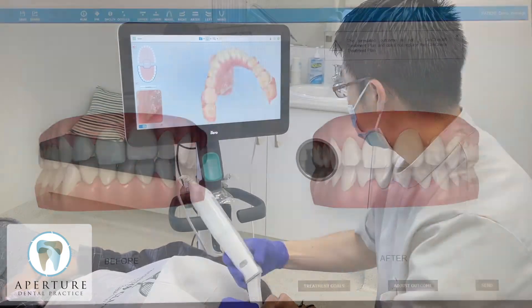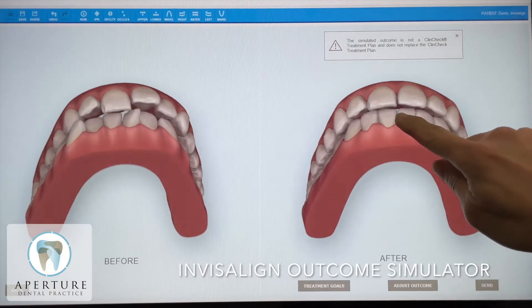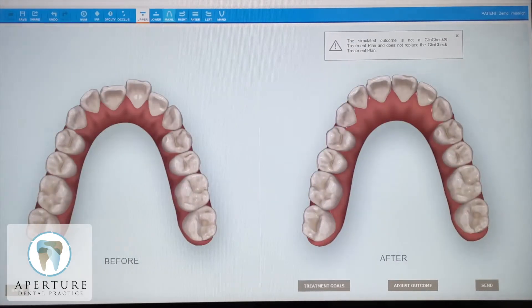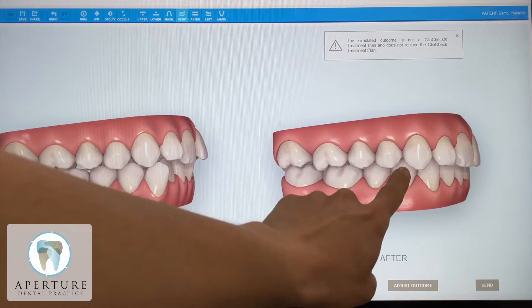Once the scan of the teeth is done, an iTero software called the Invisalign Outcome Simulator easily gives you a quick idea of the final outcome of your straight teeth. This will usually be available within two or three minutes after your scan. This will also give your dentist a chance to plan out any other dental treatment that you might need before your Invisalign treatment.